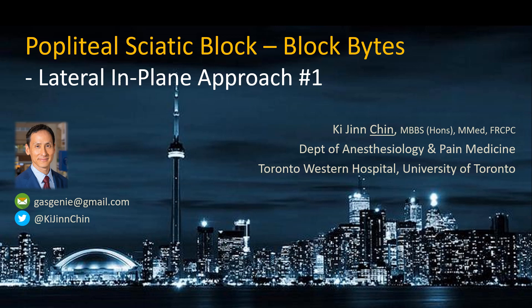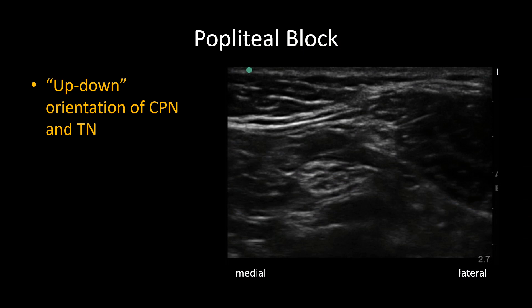This Block Bytes video illustrates a lateral in-plane approach to the popliteal sciatic nerve block, as performed by one of my trainees. As discussed in my more comprehensive video on the popliteal block, there are two patterns of orientation of the common peroneal nerve and tibial nerve at the sciatic bifurcation. One is what I call the up-down orientation, as seen here.